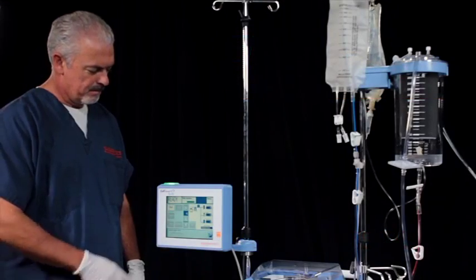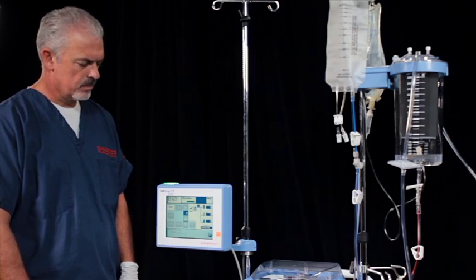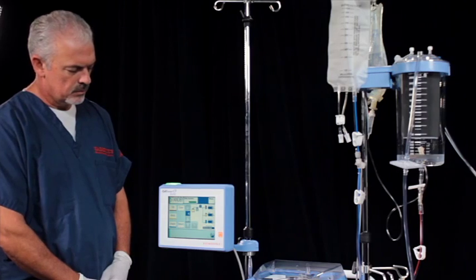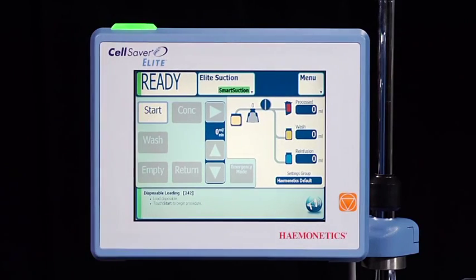If suction has not already been turned on, touch the Elite Suction button and select the type of suction desired. Before beginning to process, check the settings group located at the lower right of the screen to ensure the correct protocol is being used. Haemonetics Default is the recommended protocol to use, but another can be set up and selected in the protocol menu section discussed later. If the correct protocol is being used, begin automated processing by touching the Start button.